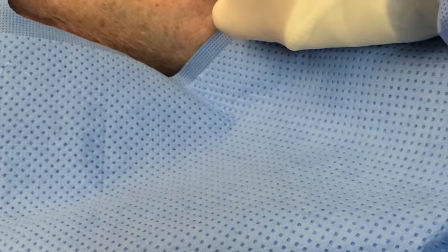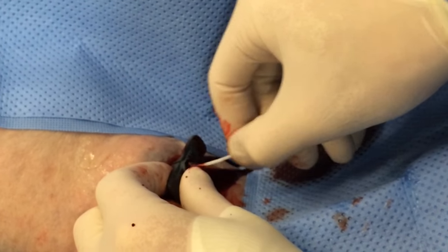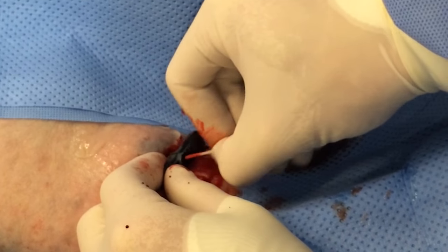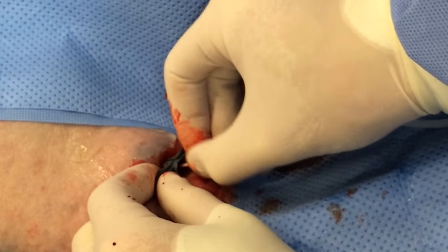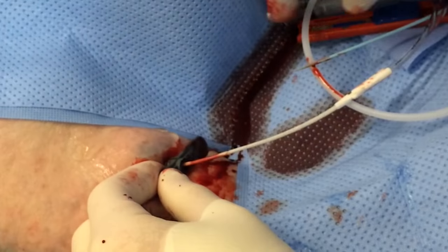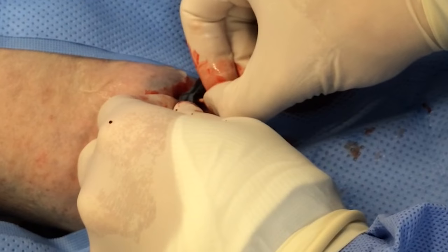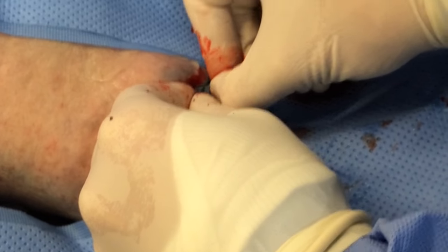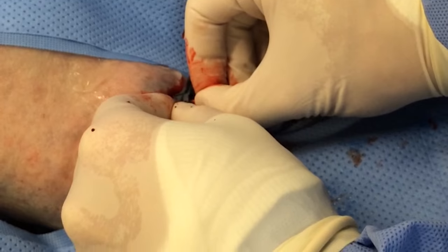Now he's going to take the pre-stiffened midline — I'll explain what all that means. He's going to gently insert it into the breakaway dilator and advance it up. Sometimes there's a little bit of friction here, but if you meet any real resistance, don't push — come on out and try again. He's just clearing out his wire guide. He's putting it in, but you don't want to put it all the way to the hub yet because you're going to need to break off that dilator.